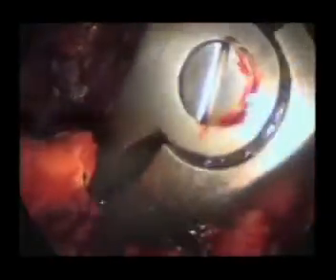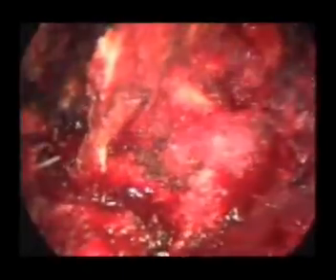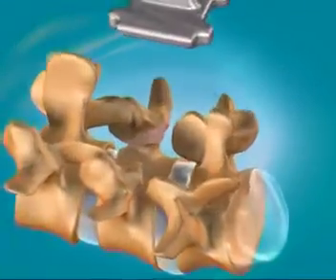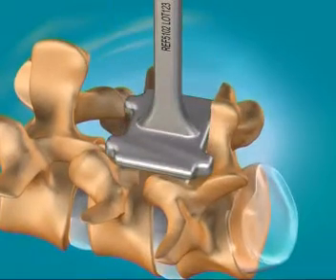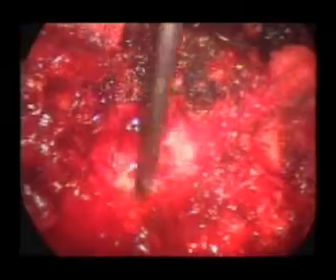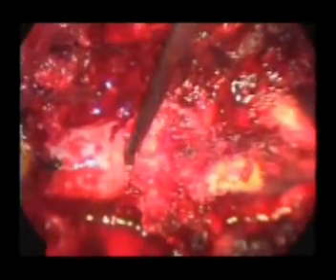Bone dissection. You should use your standard bone resection technique for decompression of the affected level. To verify optimal bone resection, use the TOPS template to verify that it fits properly between the vertebrae. Muscle dissection and retraction. As in all your procedures, it is important to avoid damage to surrounding soft tissues.